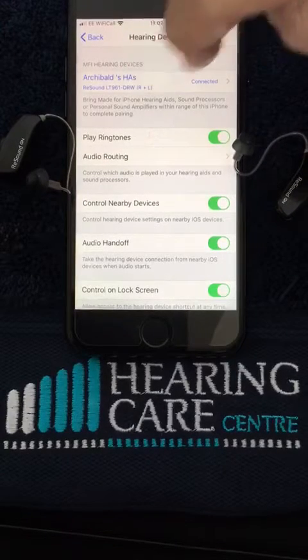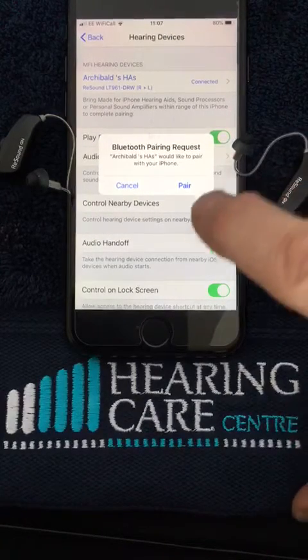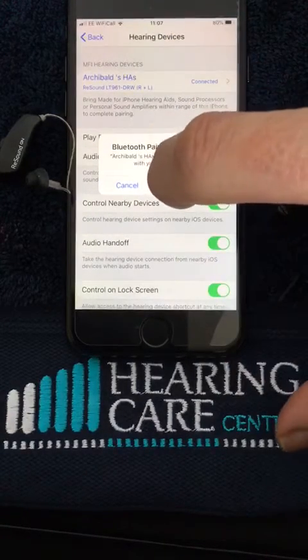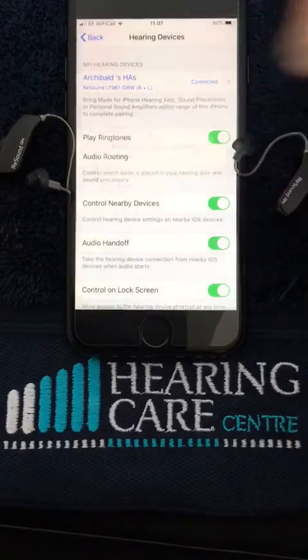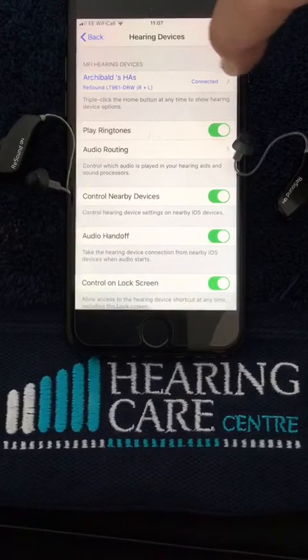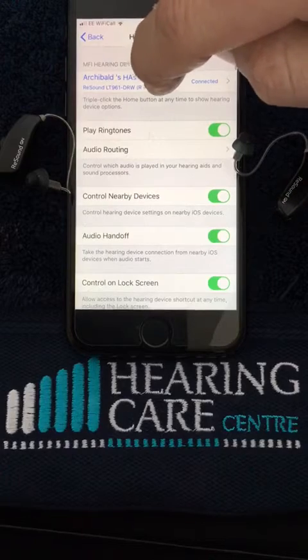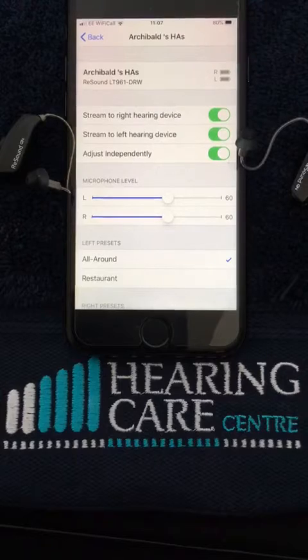It will come up at the top — the hearing aids — and they are now connected. What we need to do is pair them, so the first hearing aid we hit Pair, and then the second hearing aid we hit Pair. We can now see the hearing aids are paired and it says Connected.